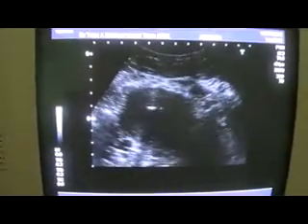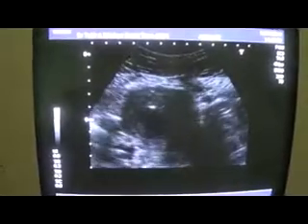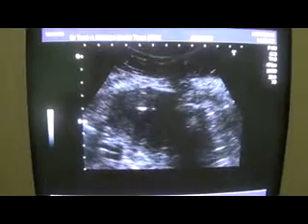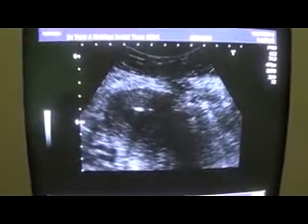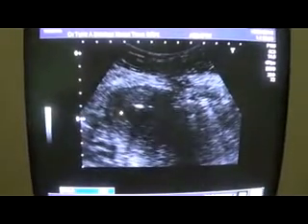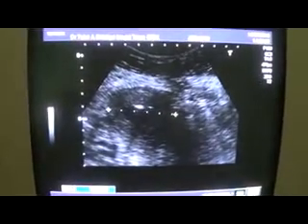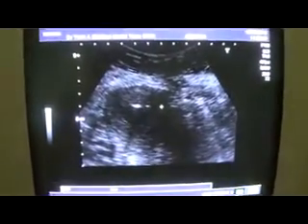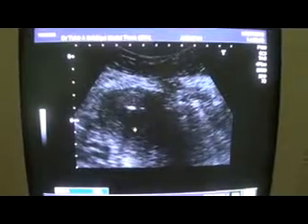Now we are seeing the transverse section of the uterus of a patient, a 30-year-old para. She had a cesarean section 3 years back, and since then she has been complaining of menorrhagia and constant pelvic pain. She has gone through many ultrasounds, but here what we see is that the uterus in transverse section is normal.